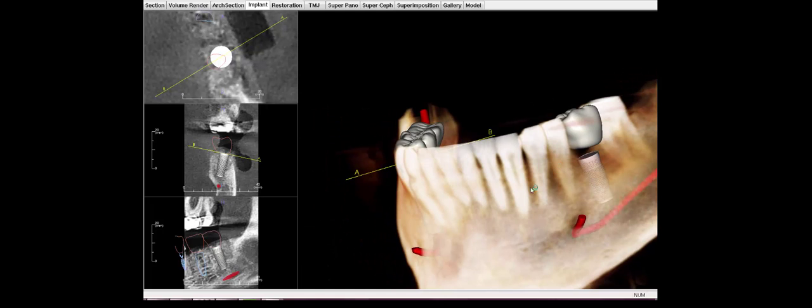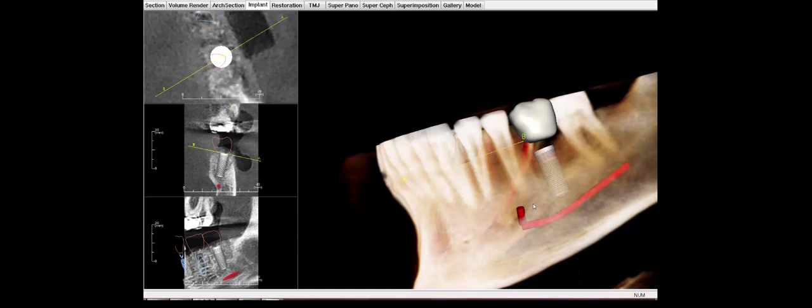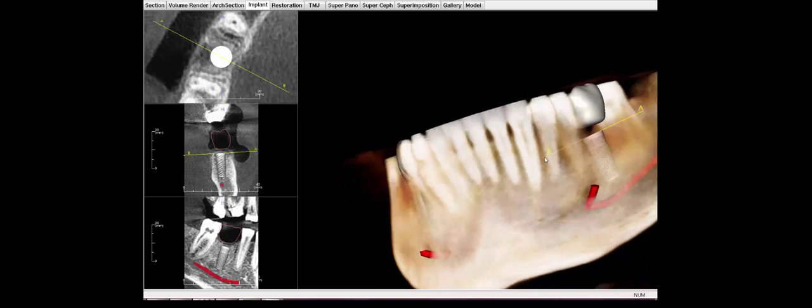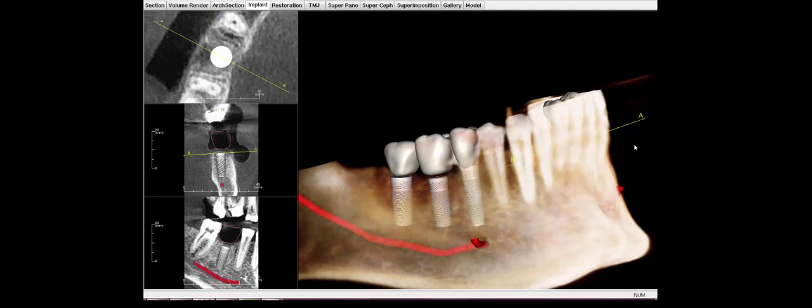So I can put really big, long implants which are great for the long term. In this area over here, you can see that this implant fits well in the bone. And these are not little skinny small ones. These are going to last a good long time for this patient.